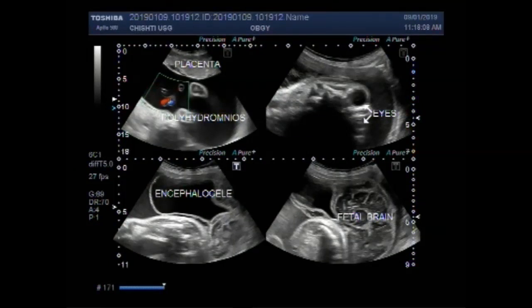Dear viewers, I hope you are all fine. This ultrasound video shows multiple fetal anomalies.